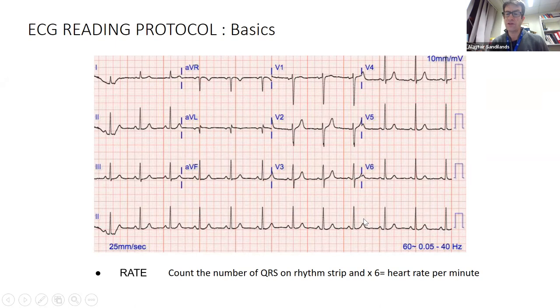Did I say 12? Yes, 72. Okay, everyone clear on that? Straightforward rate.